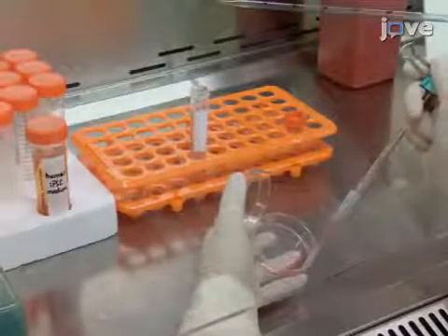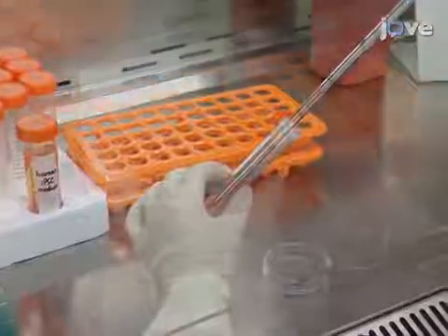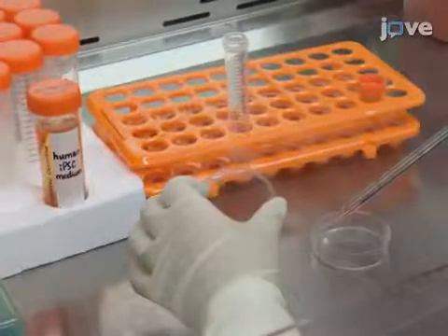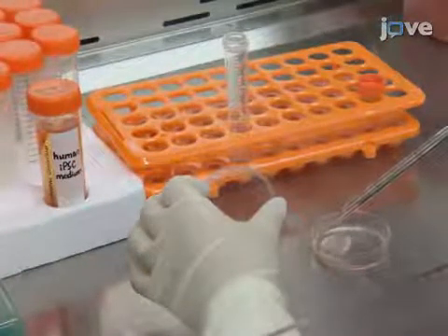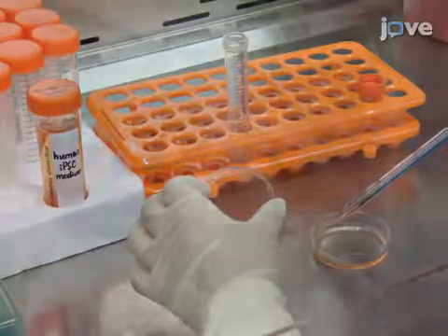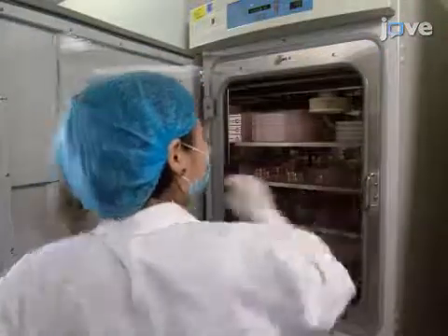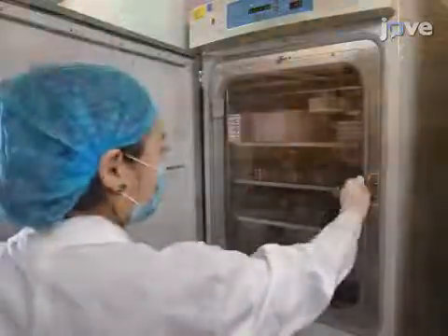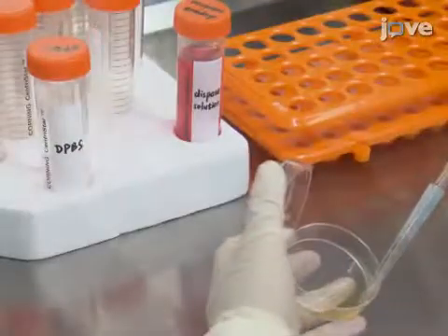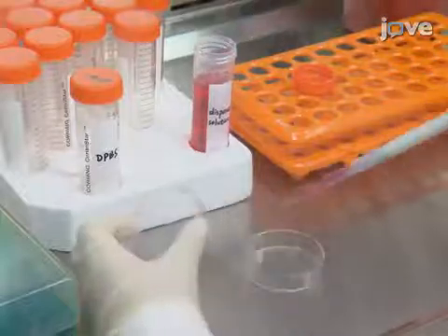Begin by plating human iPS cells in 4 mL human iPSC medium onto a 60 mm tissue culture dish containing a monolayer of irradiated mouse embryonic fibroblast feeder cells. Culture the cells at 37 degrees Celsius and 5 percent carbon dioxide. When the stem cells are 80 to 90 percent confluent, disassociate the cells with dispase solution for subculturing.